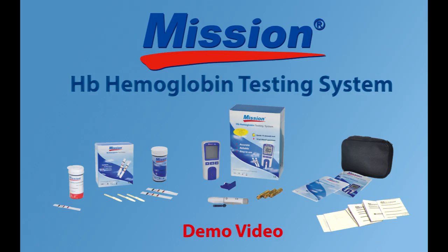The Mission HB hemoglobin testing system includes the HB meter, 10 test strips, one code chip, 10 lancets, one lancing device, one lancing device insert, two control strips, one control strip insert, 10 capillary transfer tubes, three AAA batteries, one carrying case, one test strip insert, one user's manual, one quick reference guide, and one warranty card.